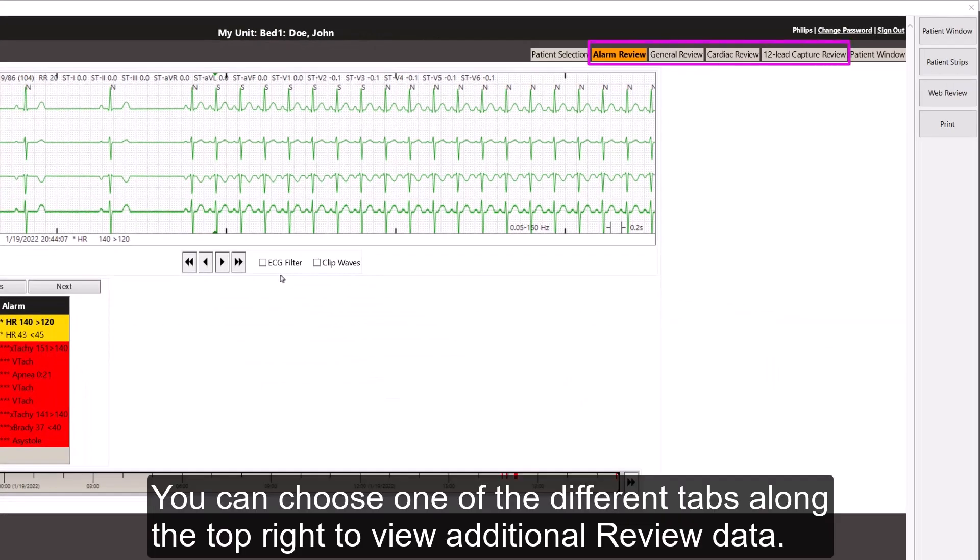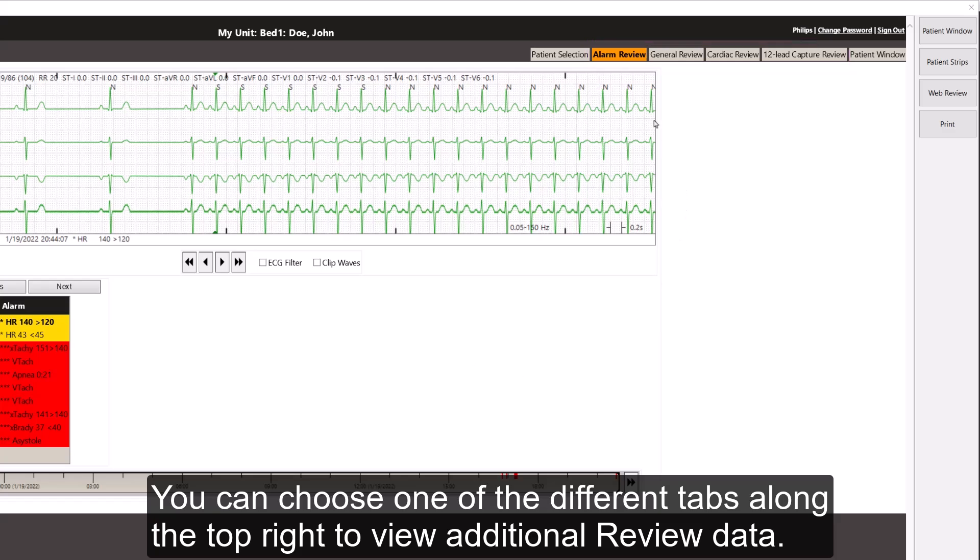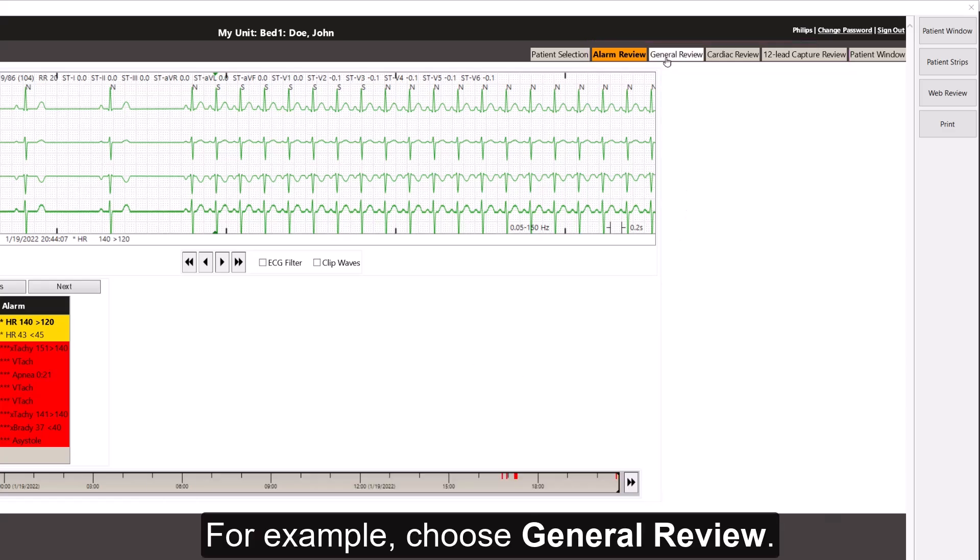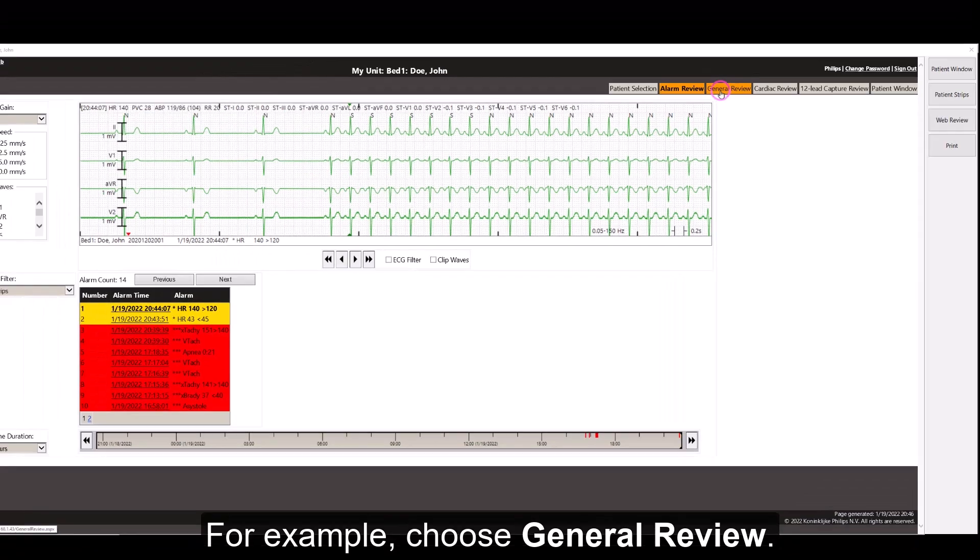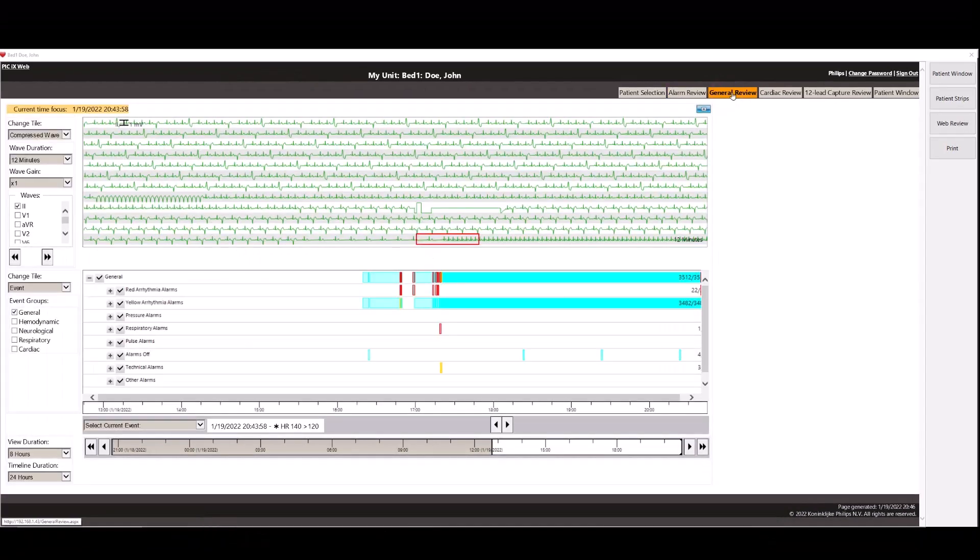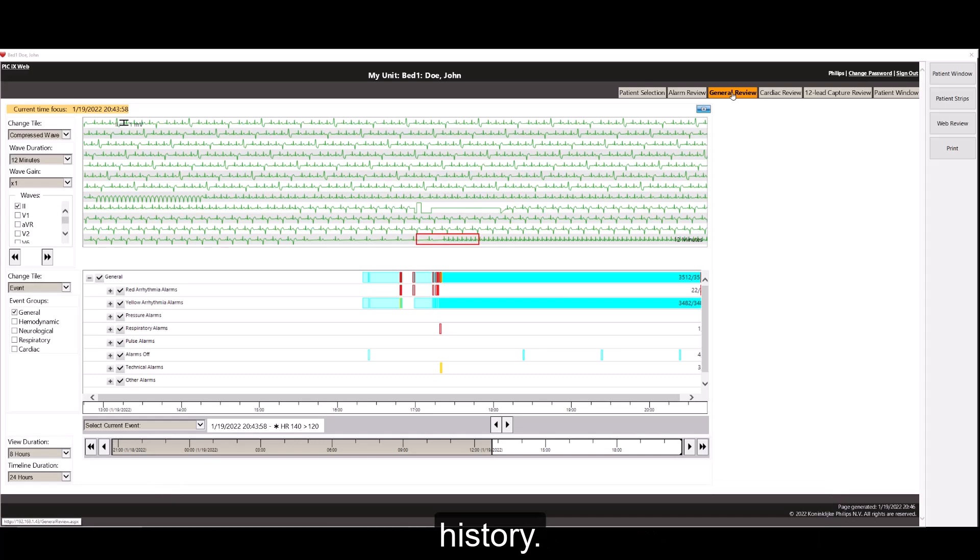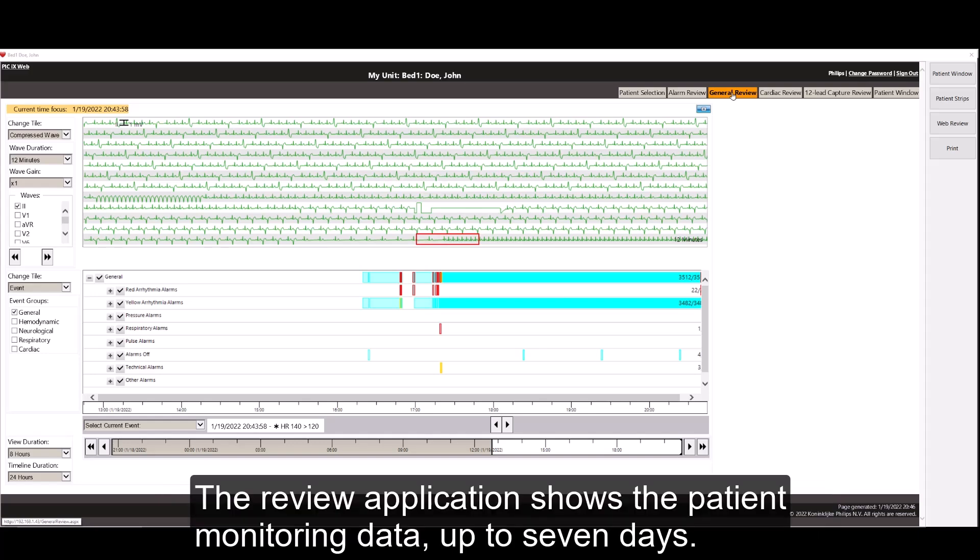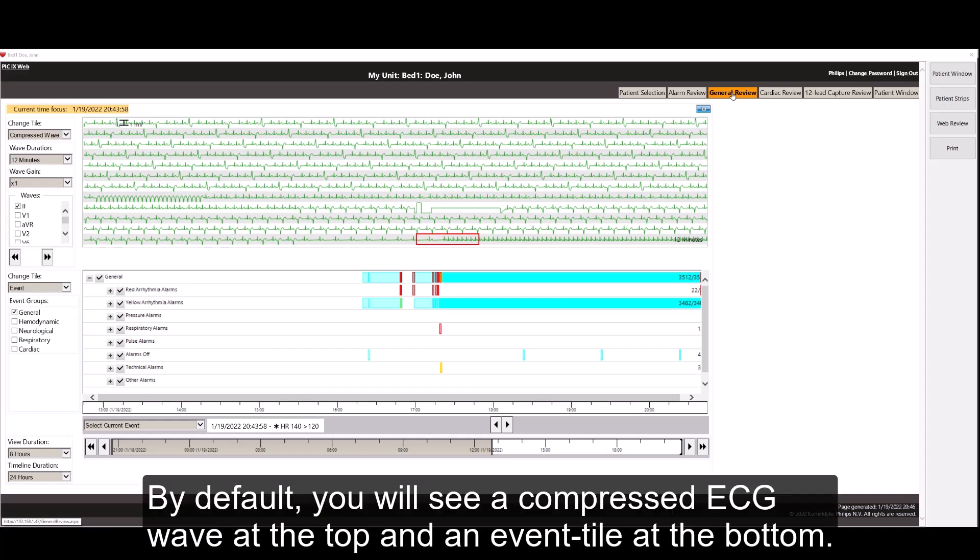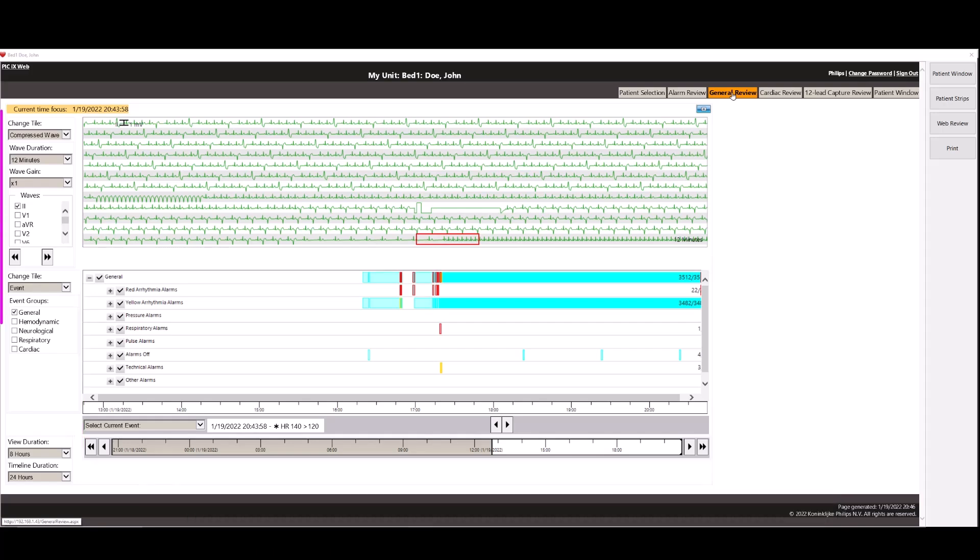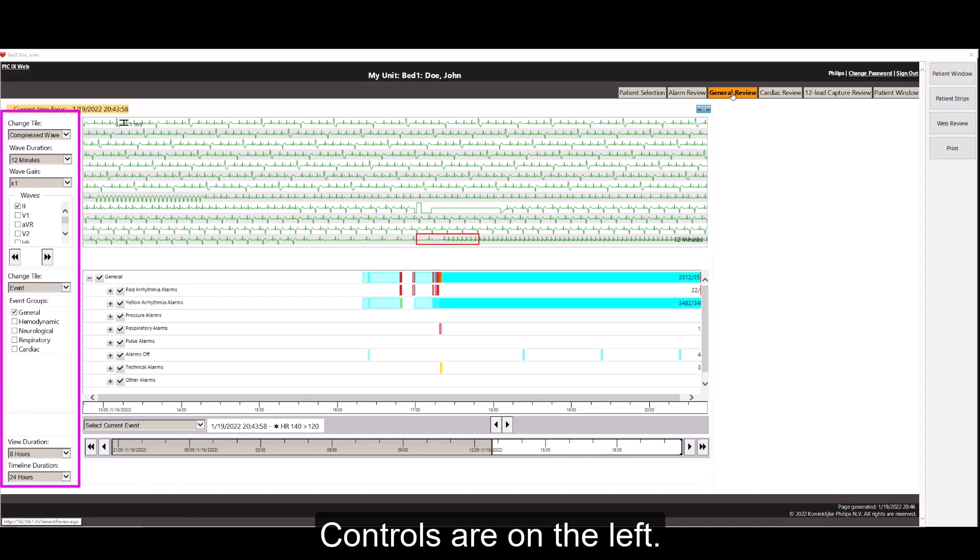You can choose one of the different tabs along the top right to view additional review data. For example, choose General Review. General Review provides a comprehensive way for you to review your patient's monitoring history. The review application shows the patient monitoring data up to 7 days. By default, you will see a compressed ECG wave at the top and an event tile at the bottom. Controls are on the left.